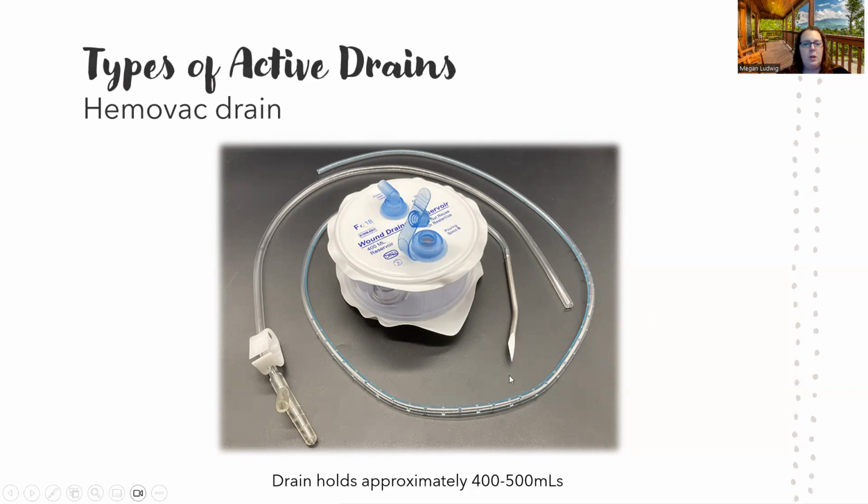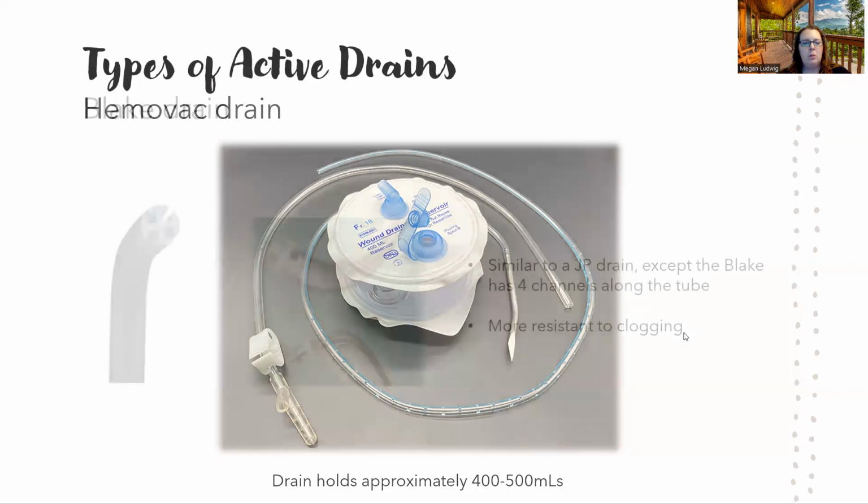This part right here that I'm pointing to, it looks like a metal spear. It really is. That's the part that's going to puncture the skin. The whole part still goes into the wound, wherever the drainage will be. And then this part gets basically pushed up through the skin to create an opening for it. And then it will get sutured to the skin. And this sharp part gets cut off and put in your sharps box. It's super sharp, obviously, going through the skin.